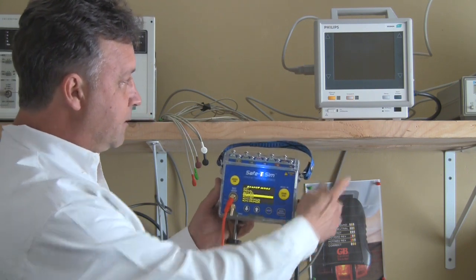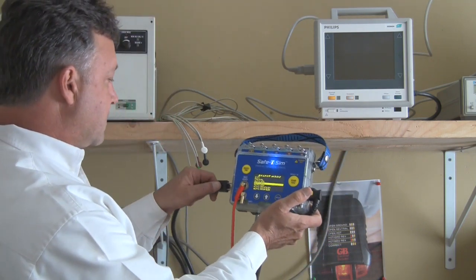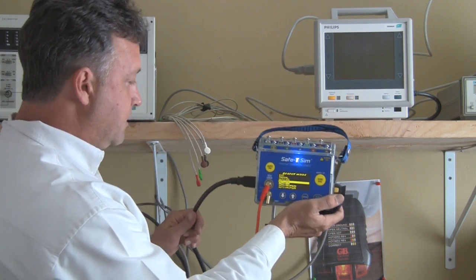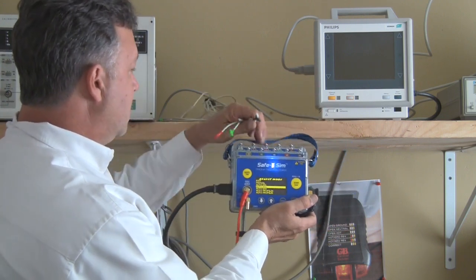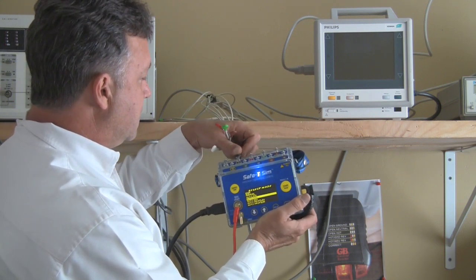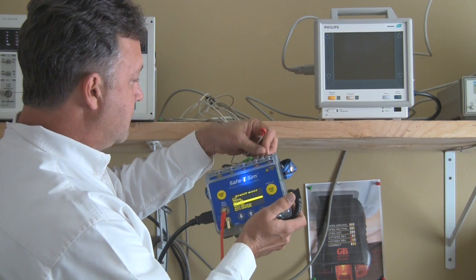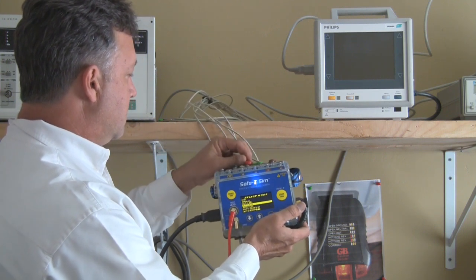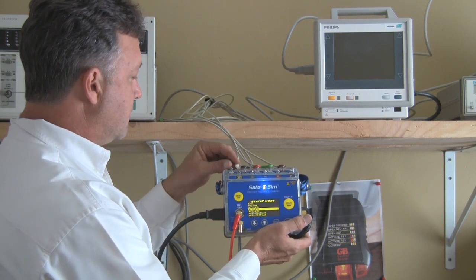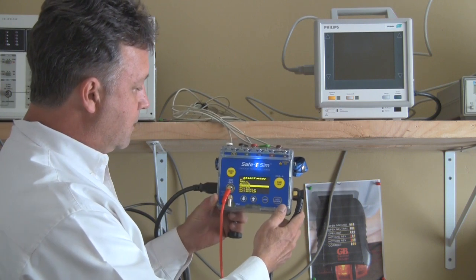If I run a test right now on this patient monitor we can actually do an electrical safety test and a simulation on it. I'm going to plug in the power cord for this device into the DUT power outlet on the safety analyzer. Now I'm going to hook up my ECG leads — those are color coded so you've got a much easier time hooking those up. In this case I'm only going to use five leads and we're ready to go.